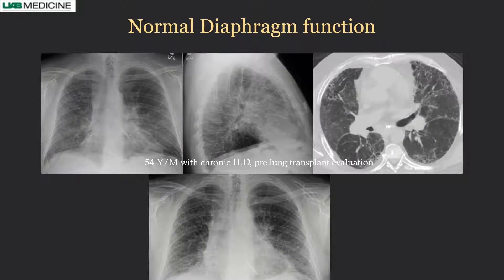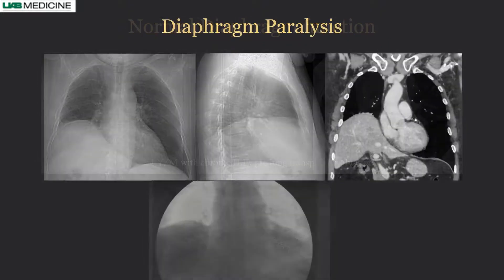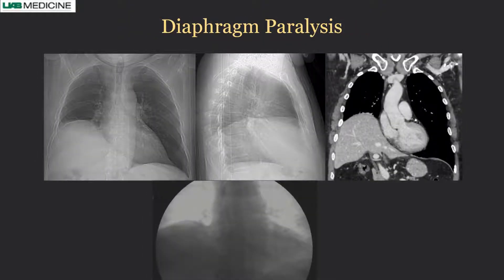Here is a 54-year-old with chronic interstitial lung disease in pre-lung transplant evaluation. The patient has both emphysema and basal interstitial lung disease. We performed DDR and showed symmetrical diaphragm movement with no paradoxical movement. This next patient has right hemidiaphragm elevation — it is completely elevated, not partial — and the liver is elevated on the lateral and coronal CT views.